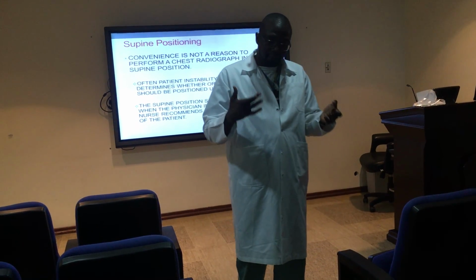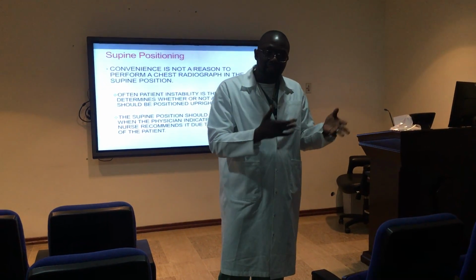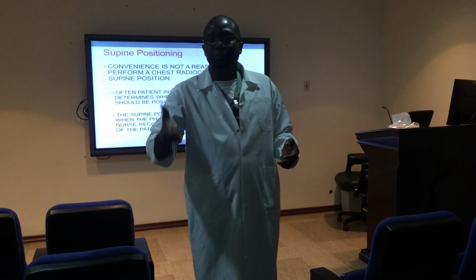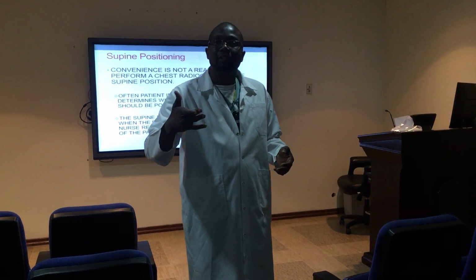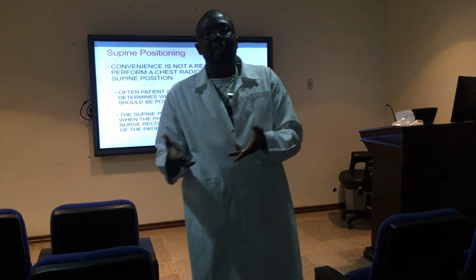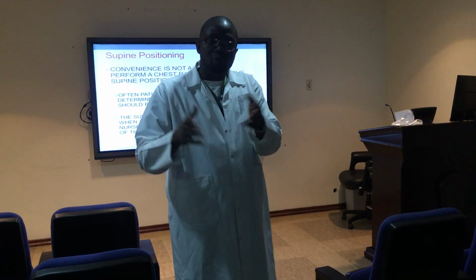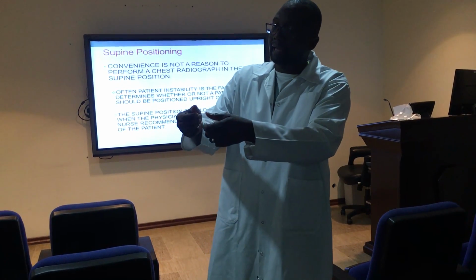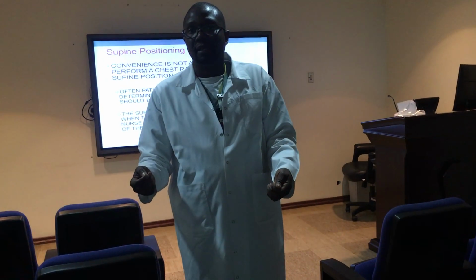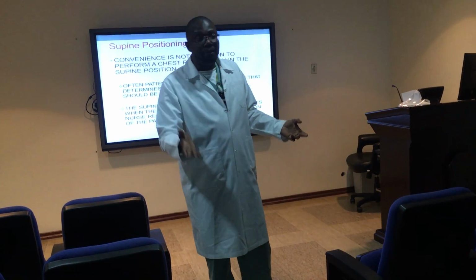Another reason why this is very important, apart from patient care and safety: if anything happens while you are in the room and the nursing staff is not with you, you did not have any communication before going in there. You don't want an IV line to be pulled out from the patient, that could cause something we don't want to our patients.